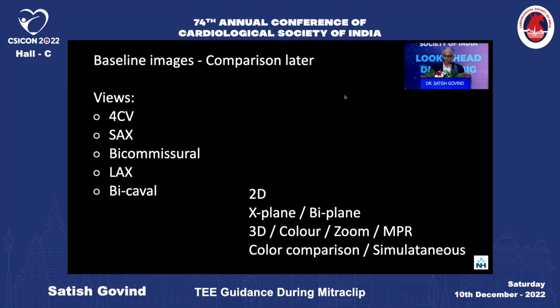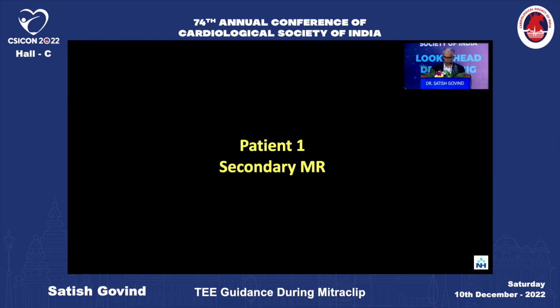And the modalities: the 2D and the X-plane or the biplane, depending on which vendor you're talking about, and then 3D color zoom, and now it is all about the multi-plane projections, which are being used a lot more, because you get everything in one go: all the views as well as the 3D, and the use of color comparison simultaneously.